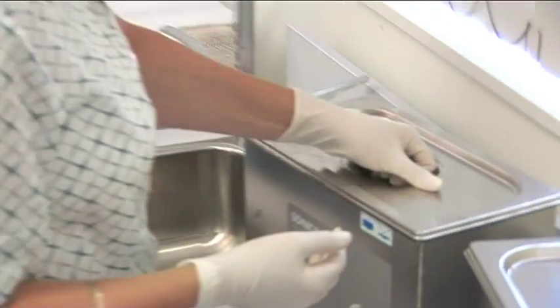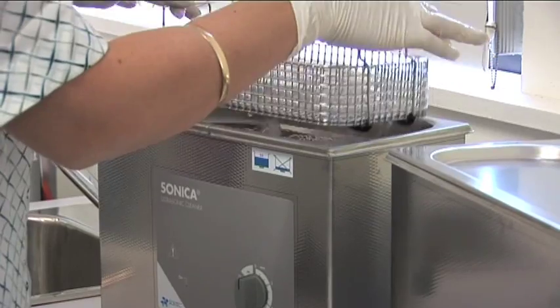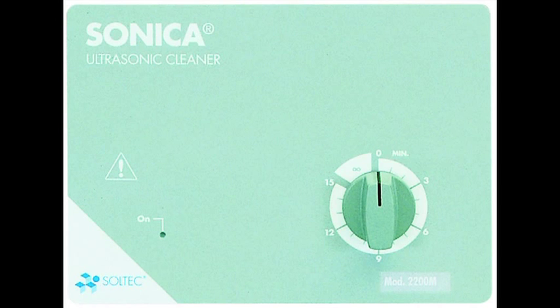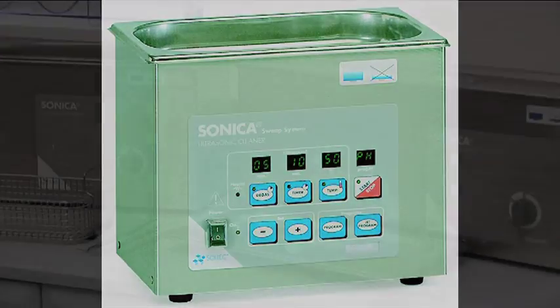All Soltech Sonica ultrasonic cleaners are supplied with a free stainless steel lid and silicon seal to minimise noise and prevent aerosol. A stainless steel basket is also provided. There are four control systems ranging from the manual countdown timer to a fully automatic electronically controlled unit with LED displays.